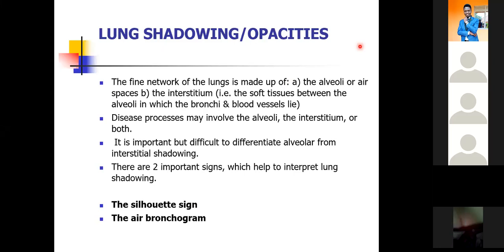So let's go down to these two important signs that help us to understand whether the opacity we are looking at is in the airspace or is in the interstitium. It helps to some good extent, but not always the case.